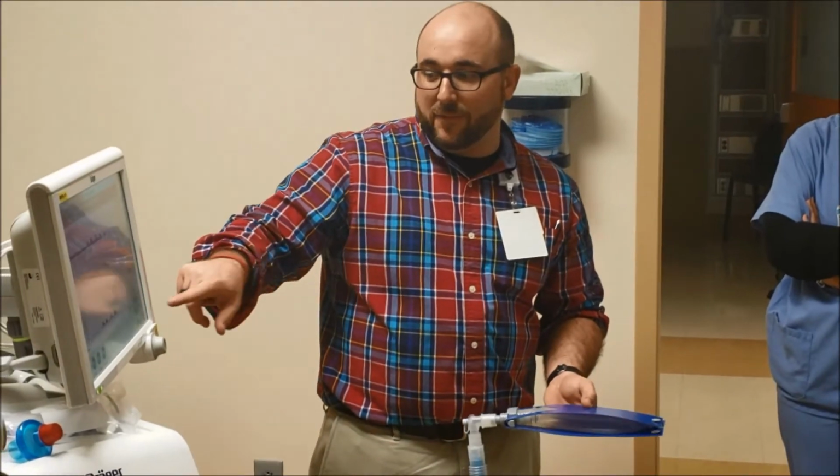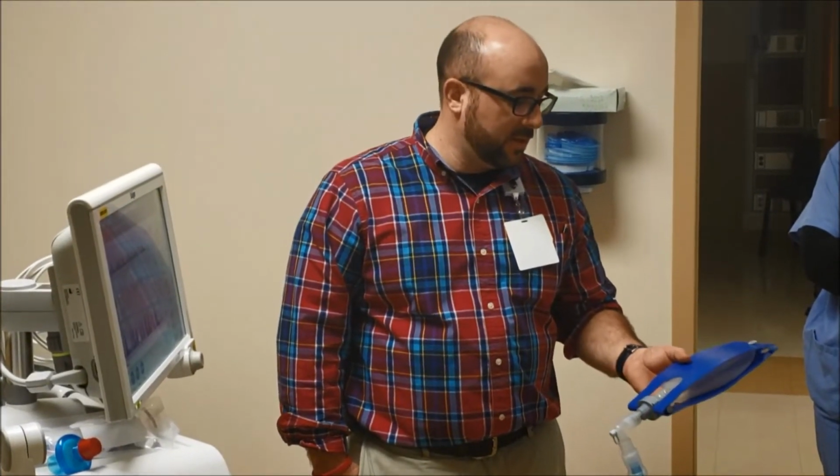But if I want to give them a breath, there are manual inspirations on that. So if you feel comfortable doing that, you can do that. And if you see they have good chest rise when you do it, that's nice to see. Other than that, you just take them off and use a bag valve mask. Like good chest rise. So that button can help in CPAP, give them a couple extra breaths, can kind of work them up a little bit. But you don't want to do that for a long period of time. As you can see though, any trigger at all triggers a breath, so it doesn't take much.